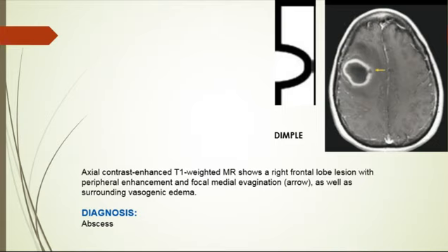Cerebral abscesses may result from penetrating trauma, surgery, direct spread of adjacent infection, or hematogenous dissemination. Various pathogens have been described, whether fungal, bacterial, or parasitic. The time of formation of a mature abscess ranges from 2 weeks to a few months. Organized abscesses demonstrate a smooth peripheral enhancing rim of fibrous collagen, which tends to be slightly thinner on the ventricular side than along the cortical margin.